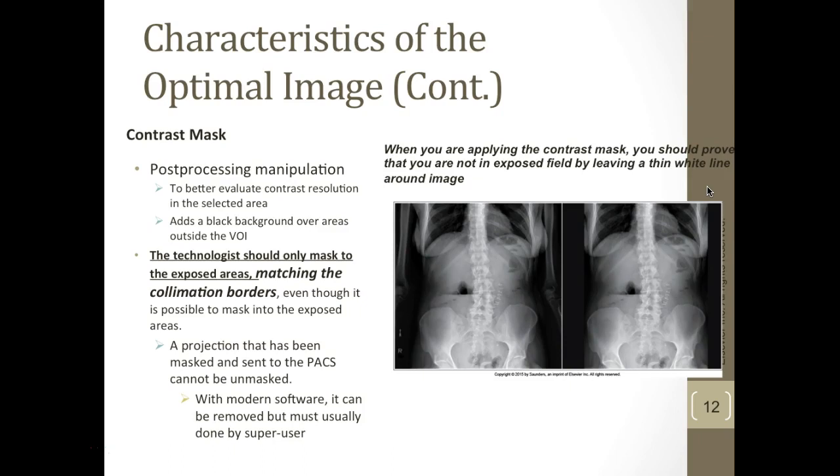Looking here, we're talking about the contrast masking. So the contrast masking is what you guys call cropping. It's called many different things. In our program, you are not allowed to mask, contrast mask, crop, whatever you call it.